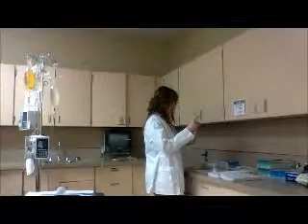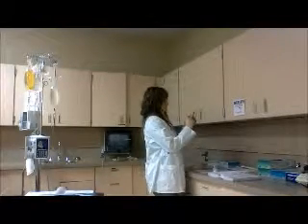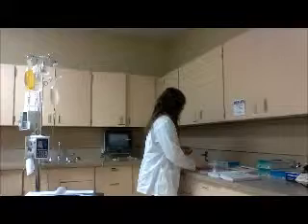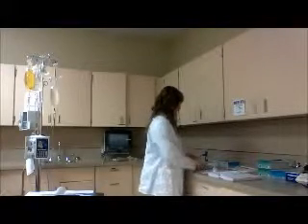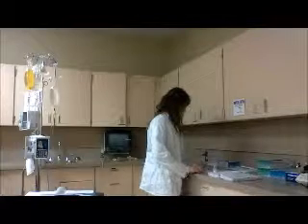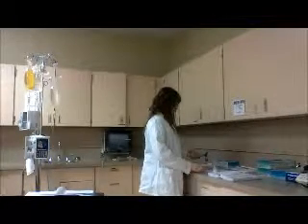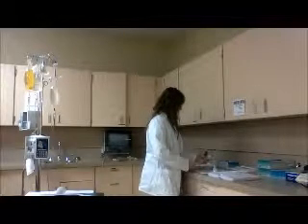Open it up. Now I'll inject that. I'm going to prime it. I'll recap it. I don't have a cap, but then I'm going to get my bag and check this with the order.